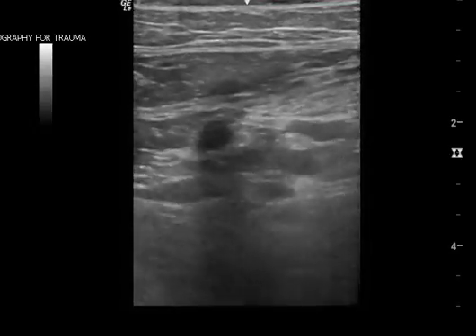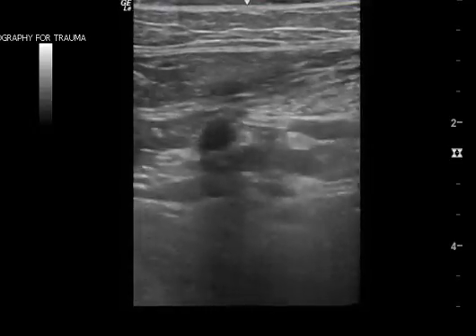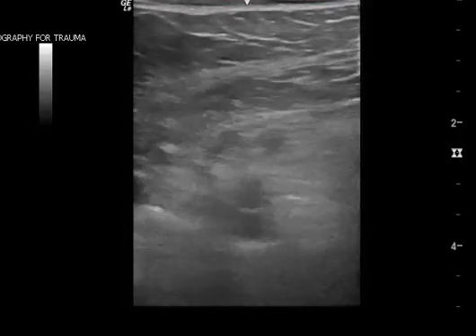This is a DVT ultrasound that was read as negative. I've been watching this clip multiple times trying to figure out if there is indeed a saphenous clot or not, and it's enough where I am a little bit concerned.